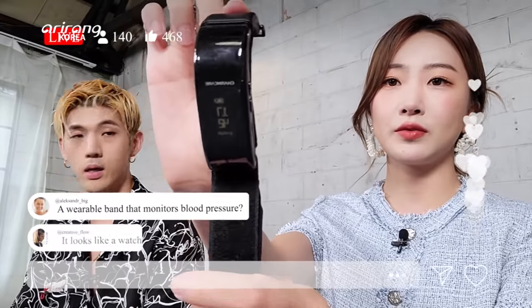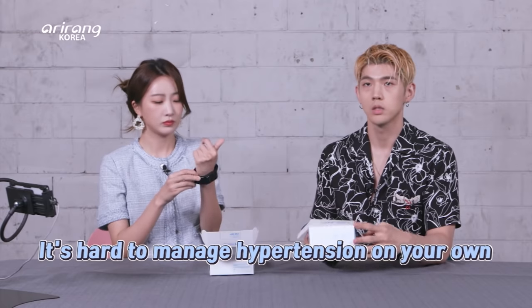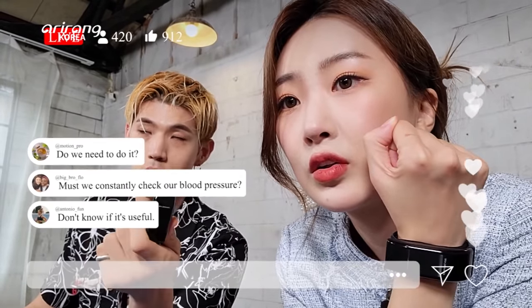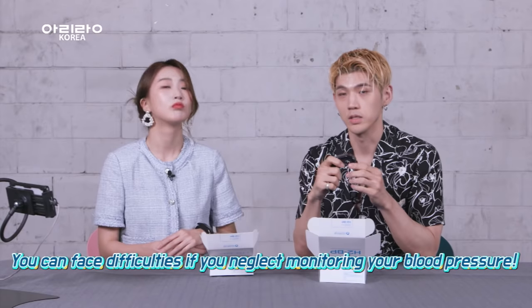H2BP. It looks very much like a watch — it's a very classic design. First and foremost, we all know blood pressure isn't easy to manage on your own. We have a fan that asked: do we need to wear this to monitor our blood pressure? Yes, absolutely. You'll be in big trouble if you neglect monitoring your blood pressure. It's very, very important.